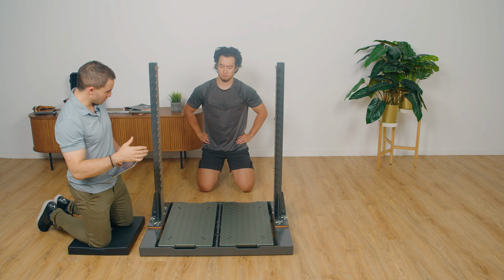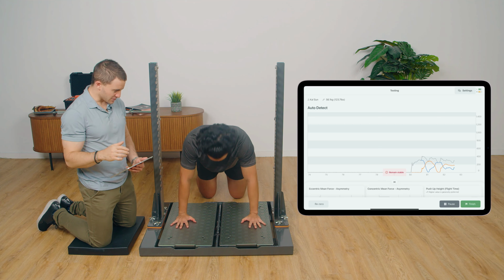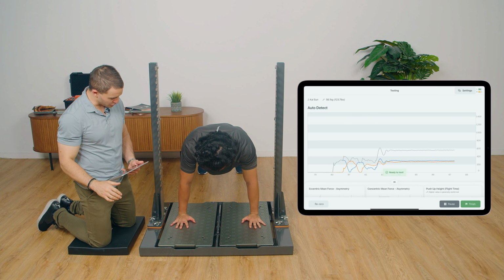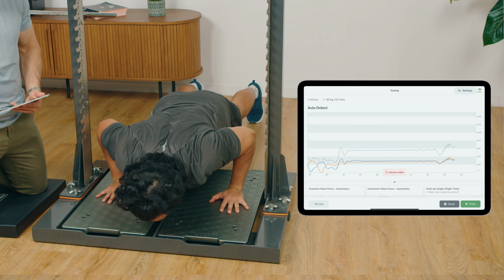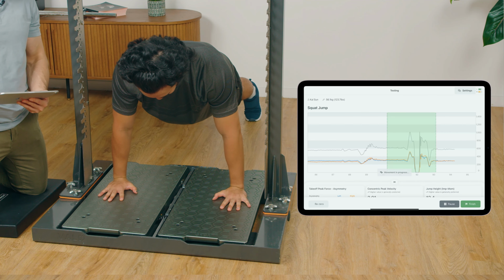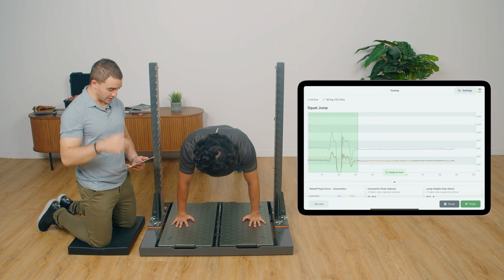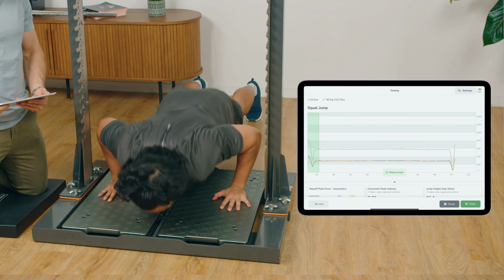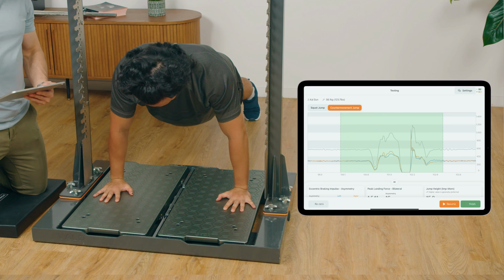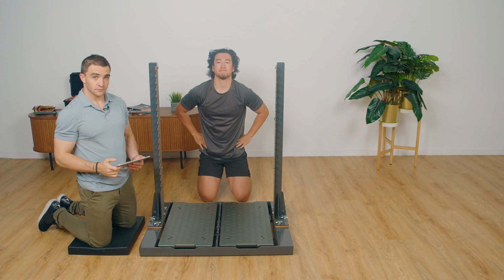So Cal, what I want you to do is when you're ready, hop into push-up position. We'll do a non-counter movement plyo push-up first. So my cue with this, Cal, is I want you to go down into the position where you're going to begin your push-up. Go ahead, go down, hold 3, 2, 1, explode off. Perfect. And that should pick up a squat jump. Awesome. Now we'll do it as a counter movement jump. Same thing we did in the plyo. Cal, when you're ready, do a plyo push-up, explode as high as you can. 3, 2, 1, go. Perfect. Nice. Awesome. And what we can do is compare the height for both of those to determine our upper body EUR.